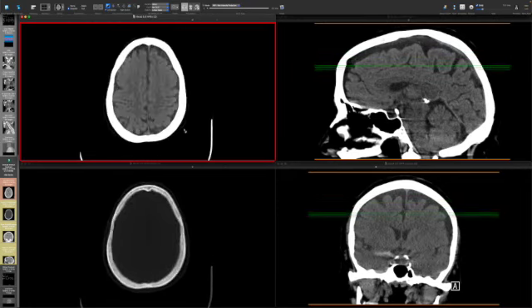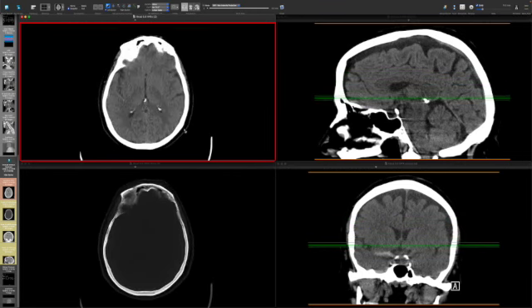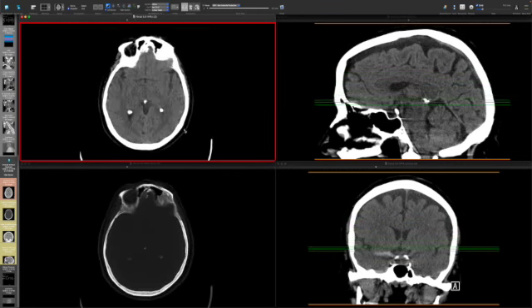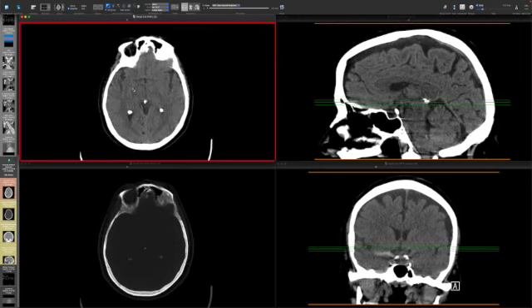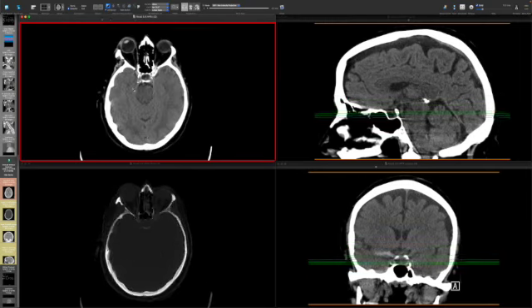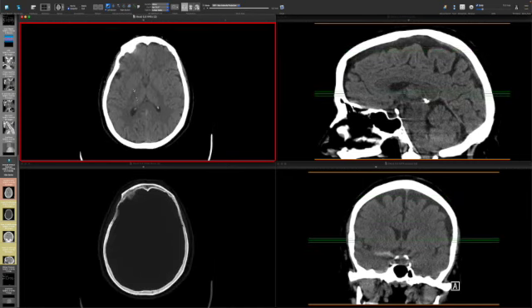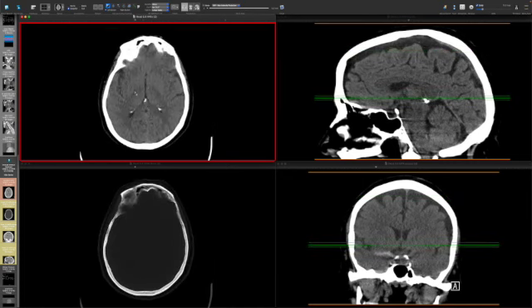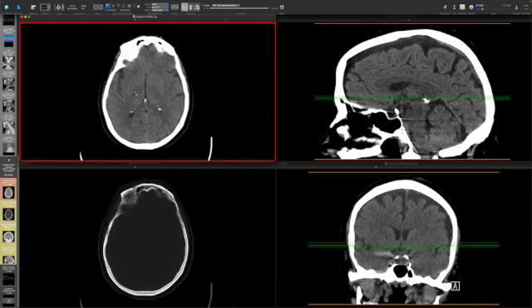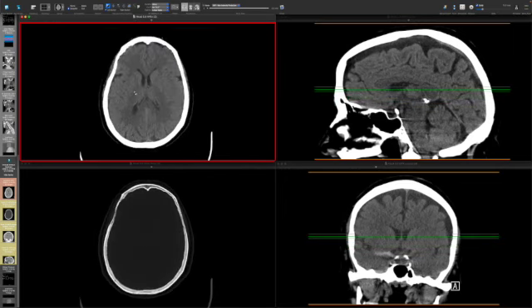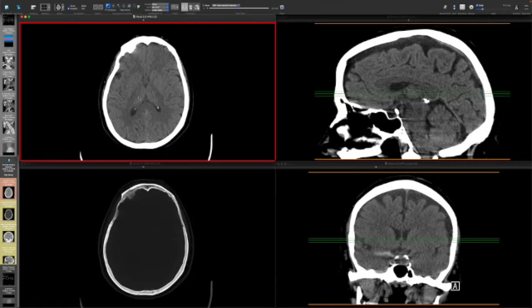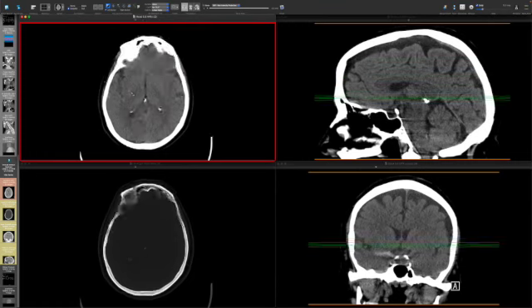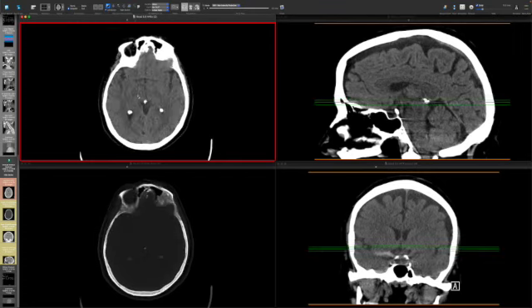So the first thing we're going to do is assess the cerebral hemispheres for symmetry and look at the differentiation of the gray and white matter densities throughout both cerebral hemispheres. And if we do a thorough examination of those findings, the cerebral hemispheres do look symmetric in appearance. There's preservation of the normal gray-white differentiation on both sides, particularly with reference to the cerebral cortex on both sides and even the deep gray structures. You can see here's the head of the caudate nuclei. They look symmetric. Here are the putamina. They look symmetric. And then the bilateral thalami. Also the insular ribbon. You can see here the differentiation in the gray and white matter on both sides.